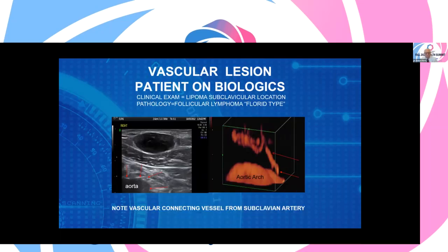Next slide, please. So false positives, here's a really important example because a lot of people now for inflammatory disease like rosacea and psoriasis, they're on biologics, which is great, but we all know that there's a slight risk of cancer from taking treatments. We have a large football-shaped area. Let's look carefully at it because the surgeon from a university hospital said, tell me it's a benign fatty tumor. And on first look, it looked like a benign fatty tumor.